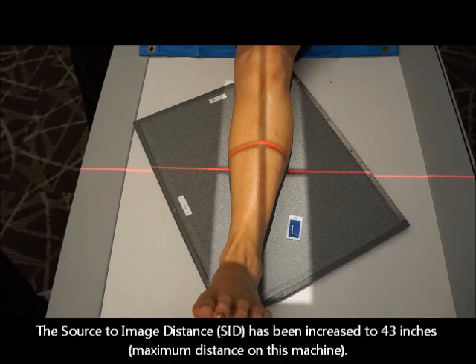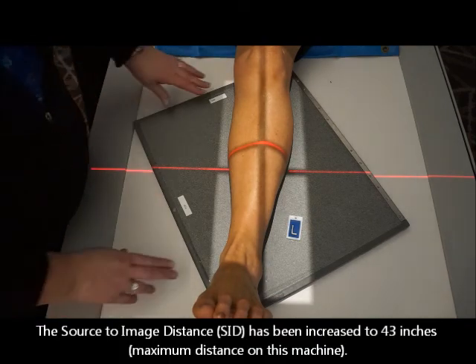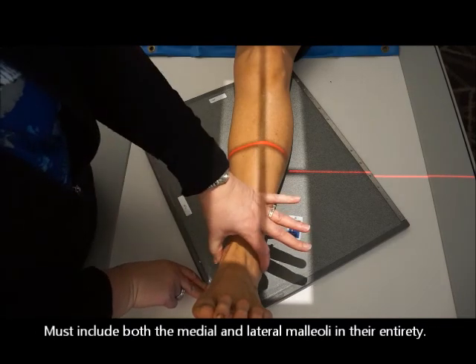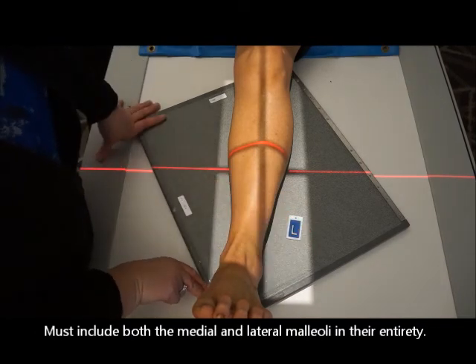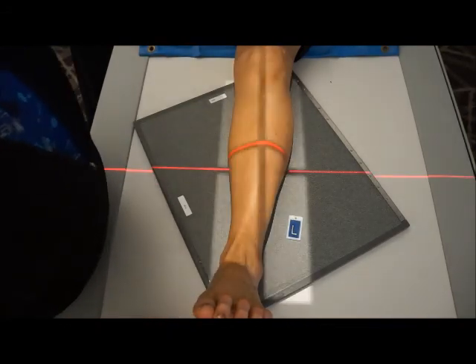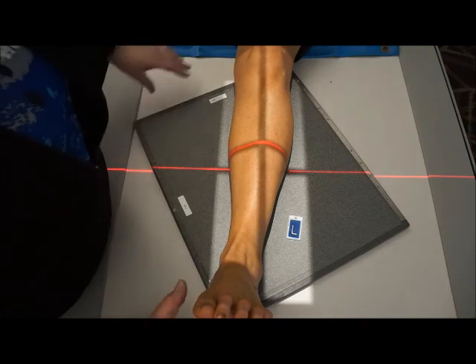Now I have increased my SID on this to 43 inches to accommodate the length of the long bone. We want to make sure that the malleoli are parallel to our image receptor, perpendicular to our central ray.